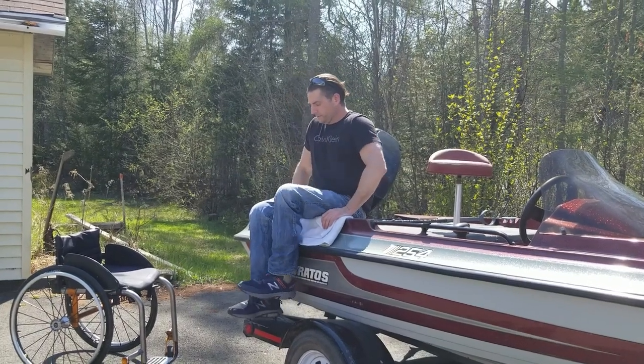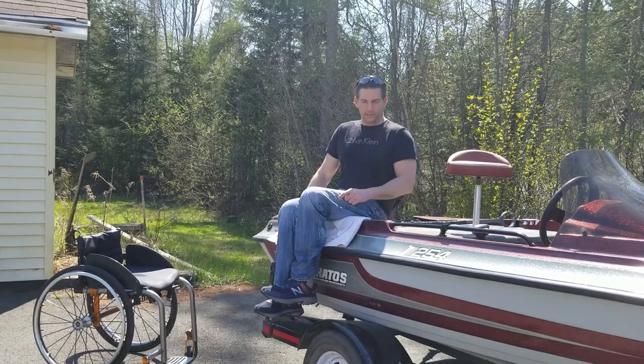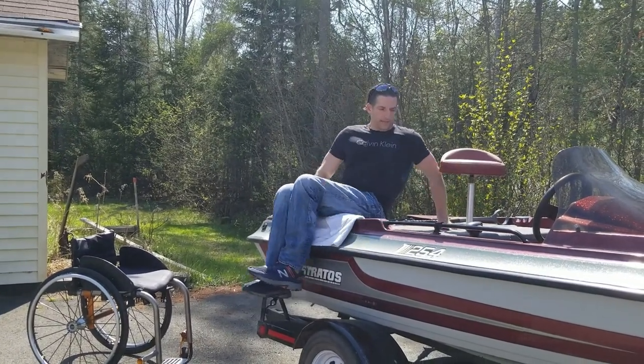So from here, I'm going to swing my legs up and around in between the two seats — the captain seat and the passenger seat.